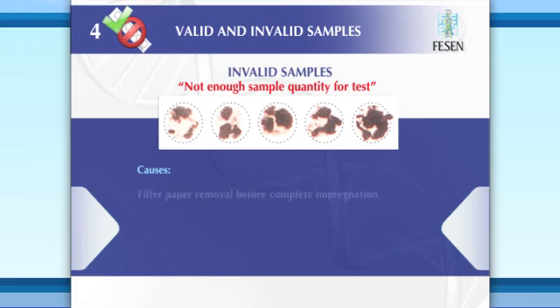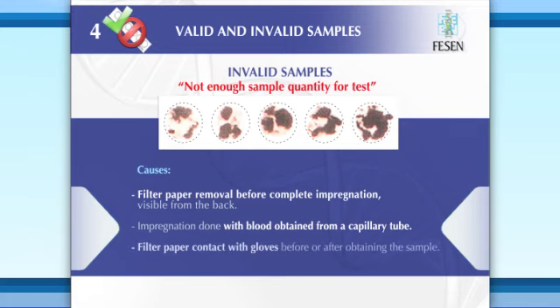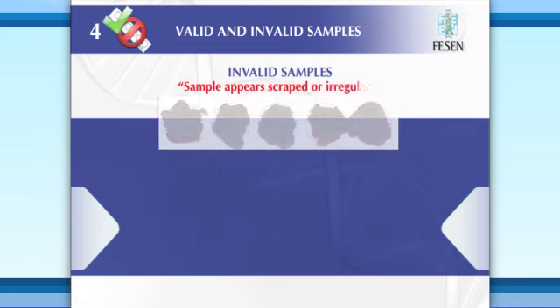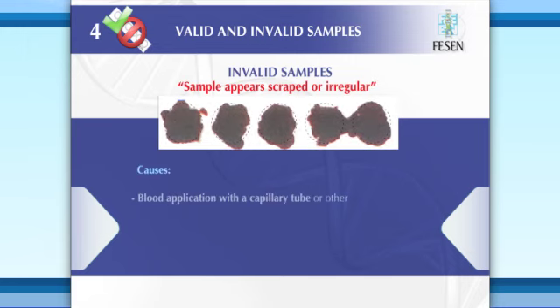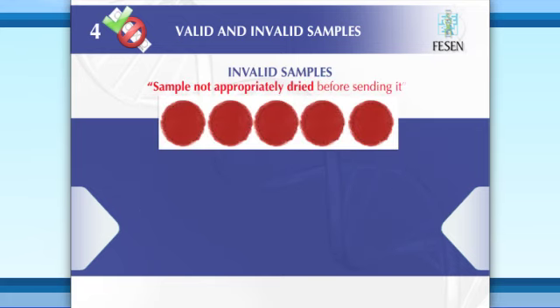Causes: filter paper removal before complete impregnation, visible from the back. Impregnation done with blood obtained from a capillary tube. Filter paper contact with gloves before or after obtaining the sample. Sample appears scraped or irregular. Causes: blood application with a capillary tube or other inappropriate instrument. Sample not appropriately dried before sending it.